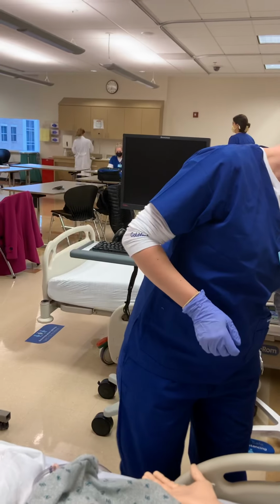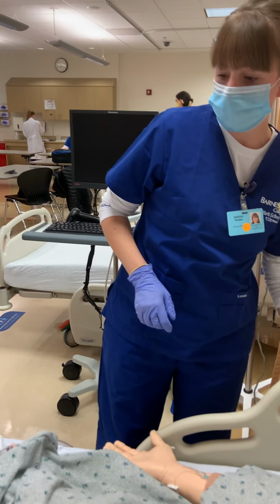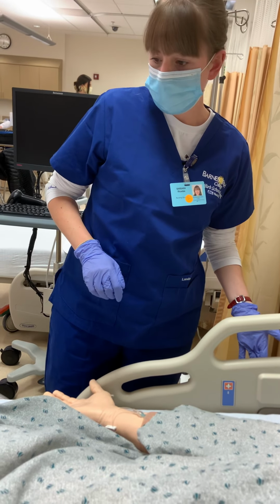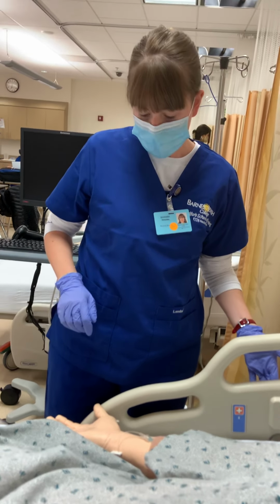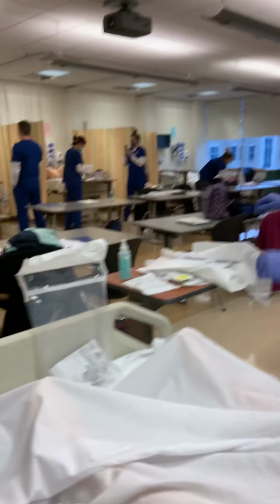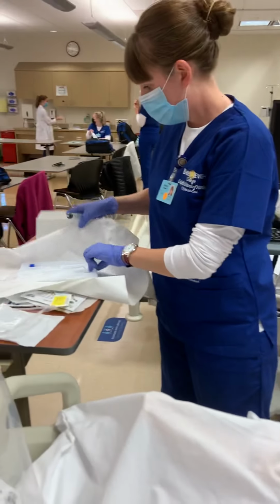All right, some minutes later I come back because I am going to get a urine sample. So I will be raising the patient's bed. All right, ma'am, this should just take a moment. I'm just going to get a quick urine sample that the doctor asked me to get for you.